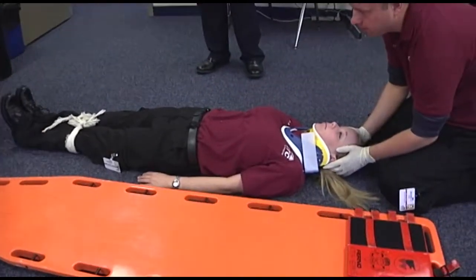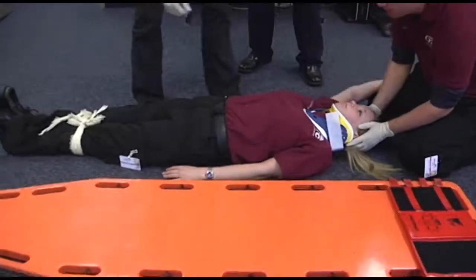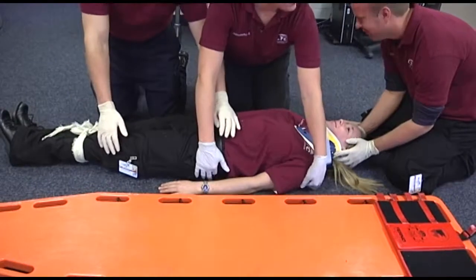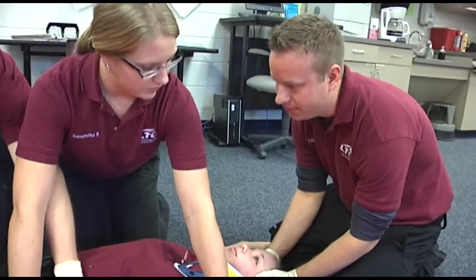With the assistance of Joshua — are you going to do it? Yeah, right now. On the count, show that the person at the head is counting. So Zach, go one, two, three. One, two, three.